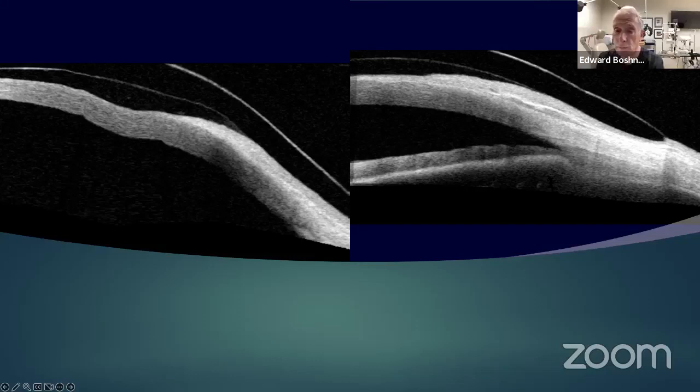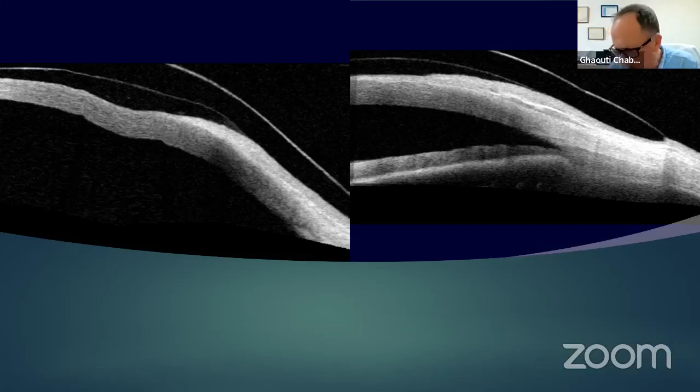Great question. Any advice for young fitters? Do you think that investing in new technologies such as OCT, SMAP, and iPrint, and I think profilometry like the eaglet, which is available in Europe and maybe other parts of the world, are something you should consider? It'll make your life a lot easier and get a more accurate fit.